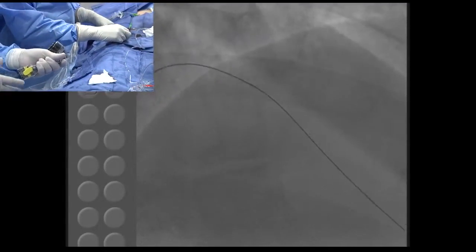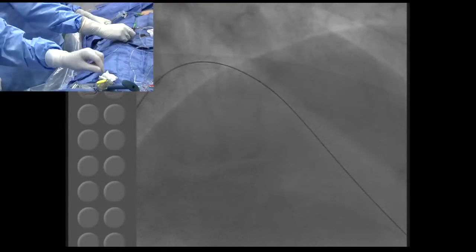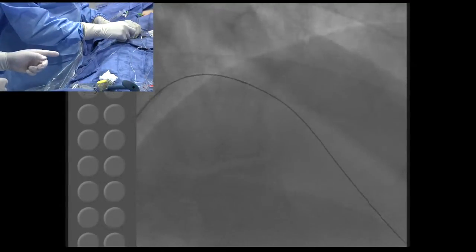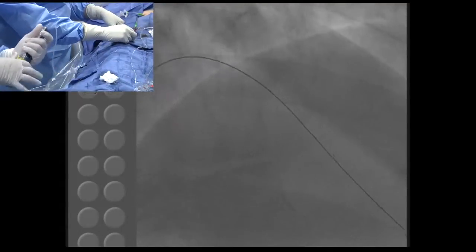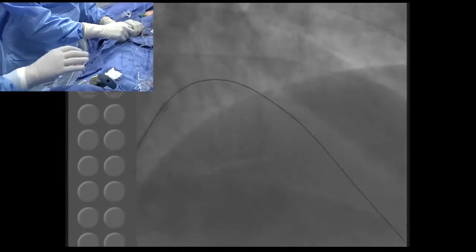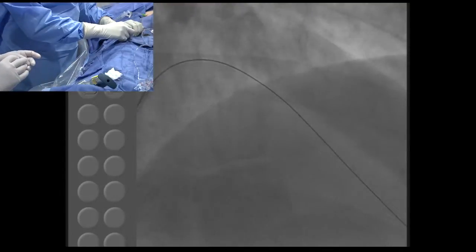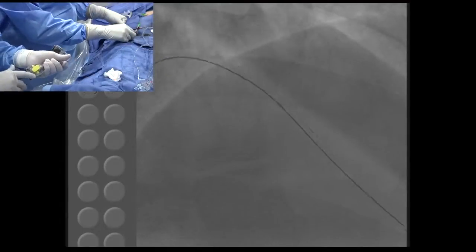No, wait one second. You have a run-through open? Yeah. Right? I can use side by side. And then also very important, the point was just made, that as soon as you have done the recanalization, I think you change to a regular workhorse wire, side by side or over the wire. Usually side by side will be good enough. So what we can do now, you have the 2.5 balloon. You want to dilate first with the 2.5 balloon, then we change.